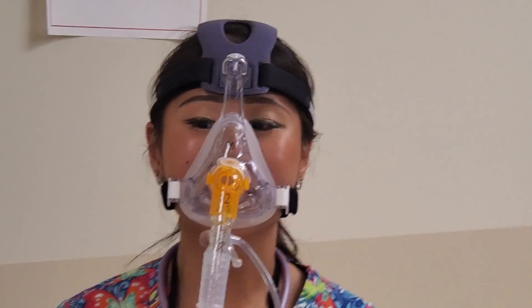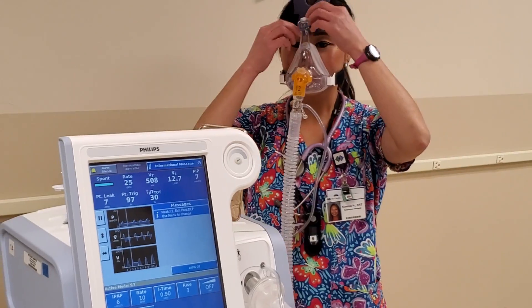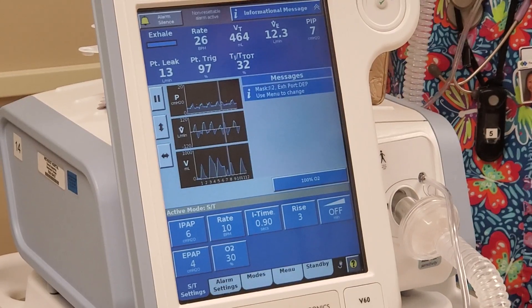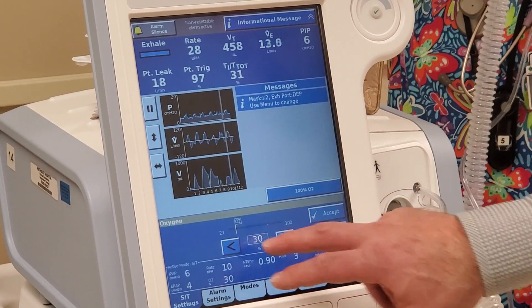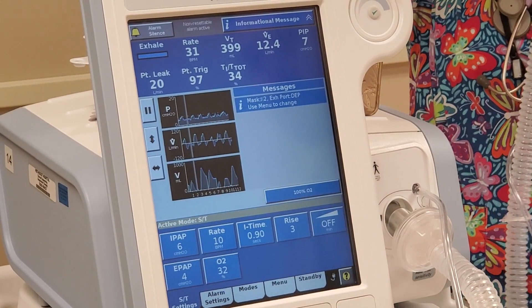Some things to look at on the BiPAP: we pointed out the leak, and we have the FiO2 right here. If you're monitoring the saturations and they become low or too high, you can press this to adjust up or down and then accept to change the FiO2.